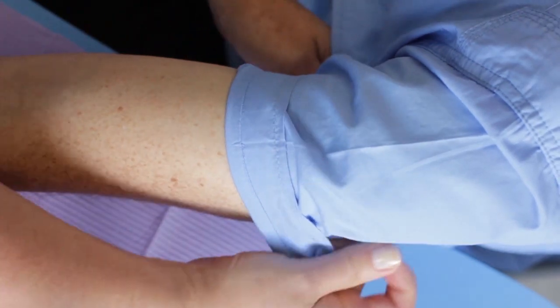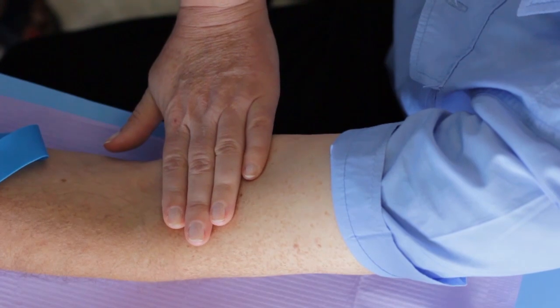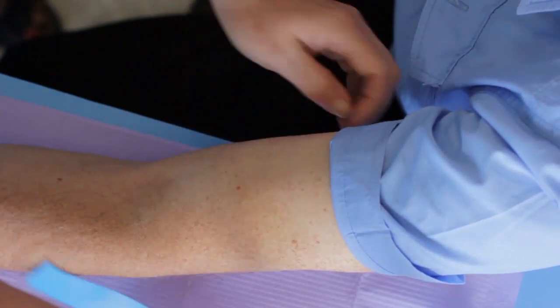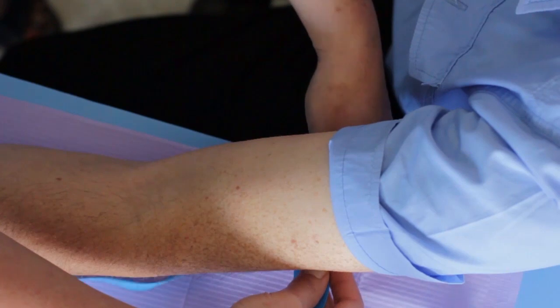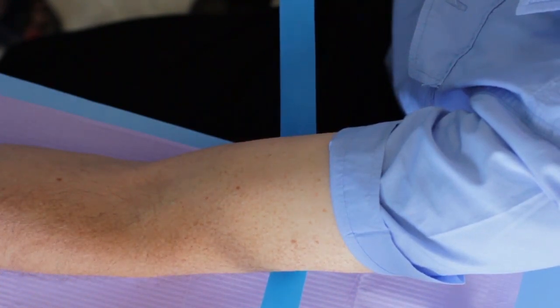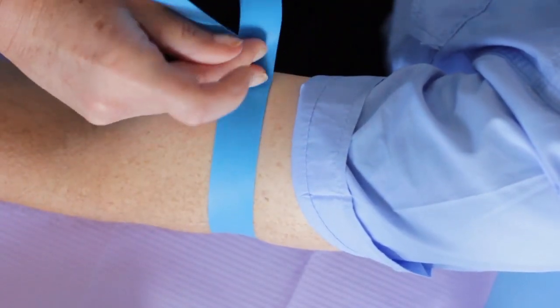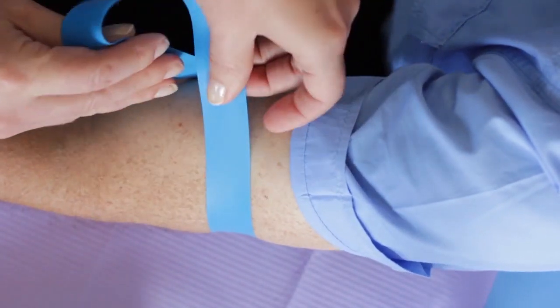Expose the arm to the mid-upper arm area. Place the tourniquet under the patient's arm about four finger-widths above the elbow. Holding one end in each hand, ensure that the tourniquet lies flat on the skin surface. Swap the two tourniquet ends to opposite hands so that the end on the right is closer to you.